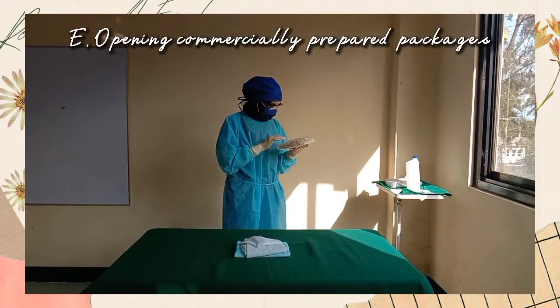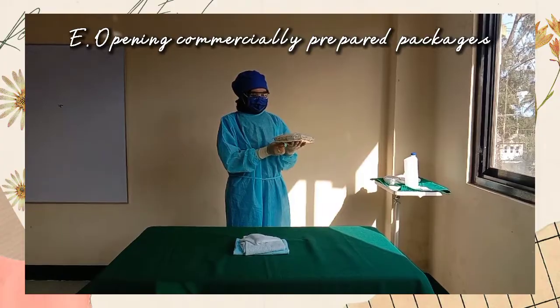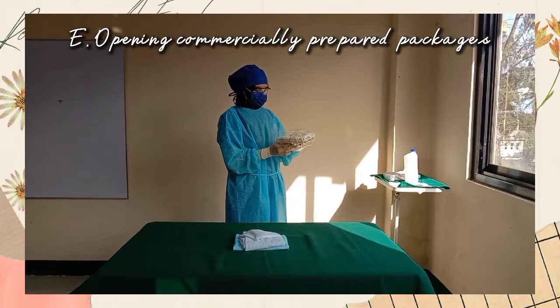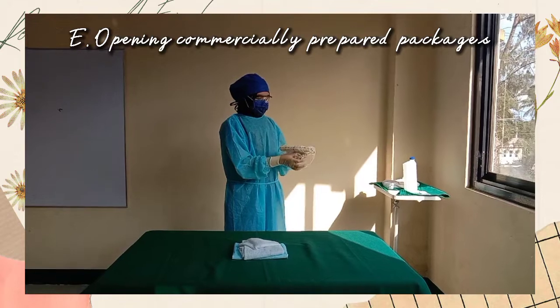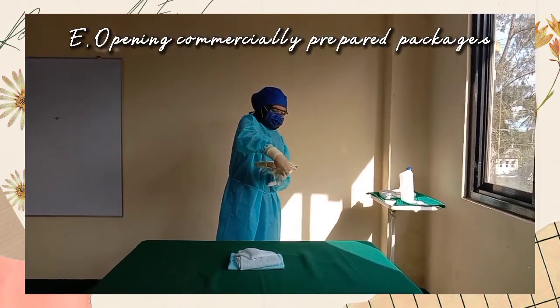If the flap of the package has an unsealed corner, hold the container in one hand and pull back on the flap with the other hand to prevent contamination. If the package has a partially sealed edge, grasp both sides of the edge, one with each hand, and pull apart gently to prevent touching the sterile area with unsterile hands.